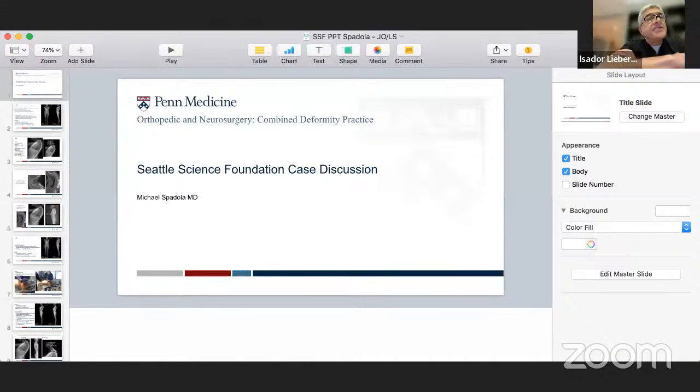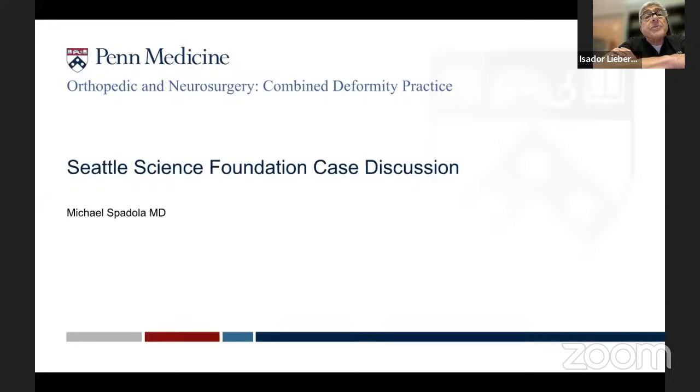Vince, it's Izzy. Great talk. Great topic. One of the things that I found very, very helpful, much like your double suspended Gardner-Wells traction, is the pneumatic headrest that you can clamp onto the Jackson table. And it's got 2 handlebars on it that, very much like what you were describing, allow manipulating the cervicothoracic junction.